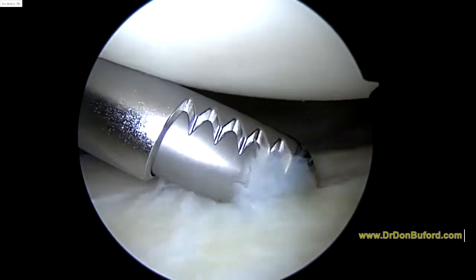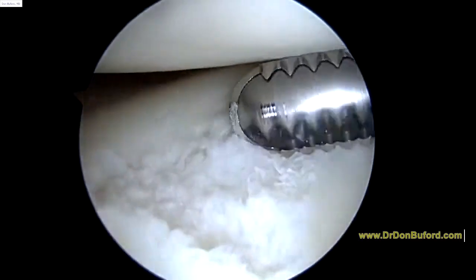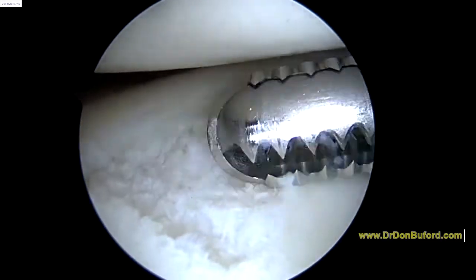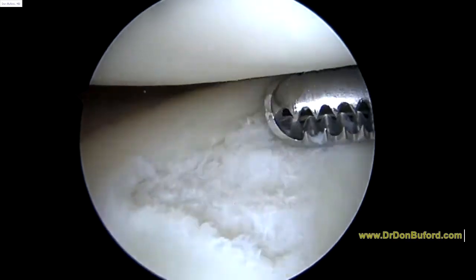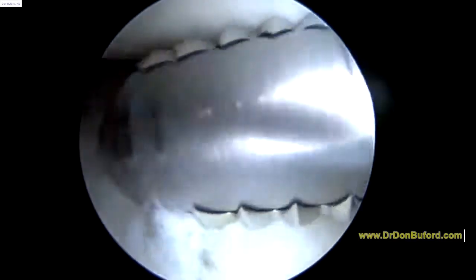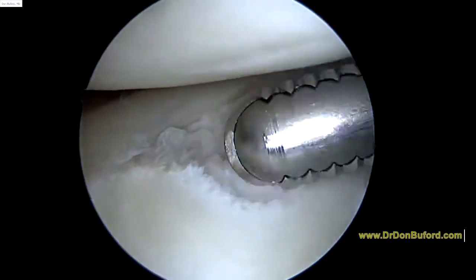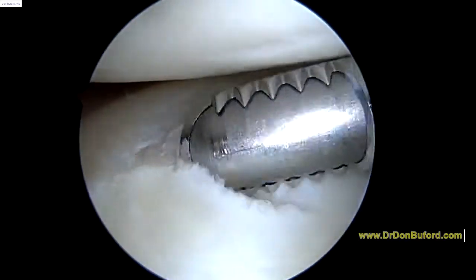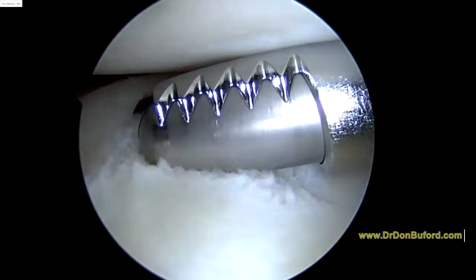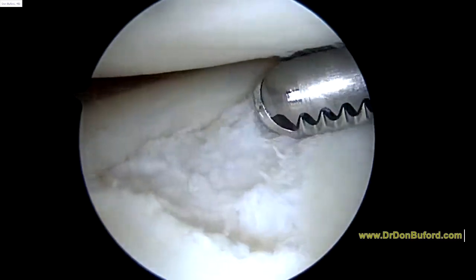You can see that that's a little bit loose, and we can help with that. We're looking from the front — the shaver is now coming in from the back of the shoulder. You can see this area that had cartilage that was quite a bit loose. I don't want to remove anything more than I have to, but I sure don't want to leave a loose flap. This is the anterior labrum that you can see is a bit loose, but that should be okay. It was this articular cartilage that I was more concerned about. Trying to make sure the edges are stable.